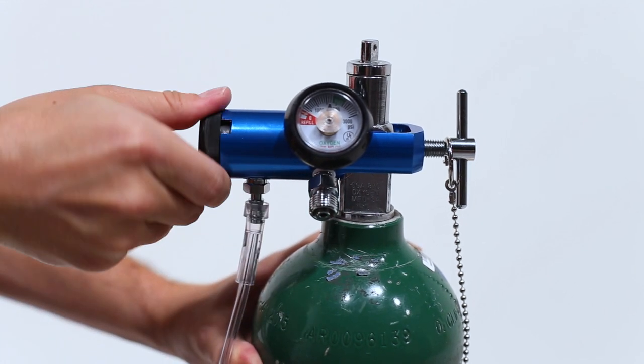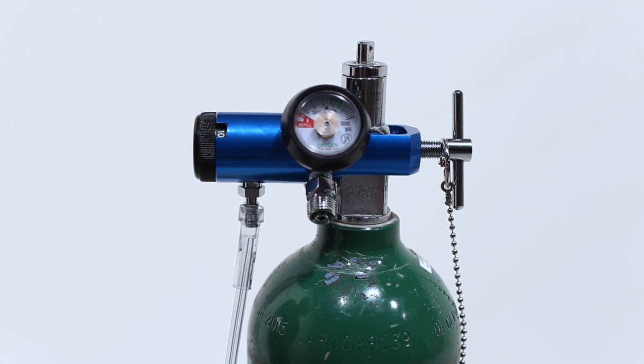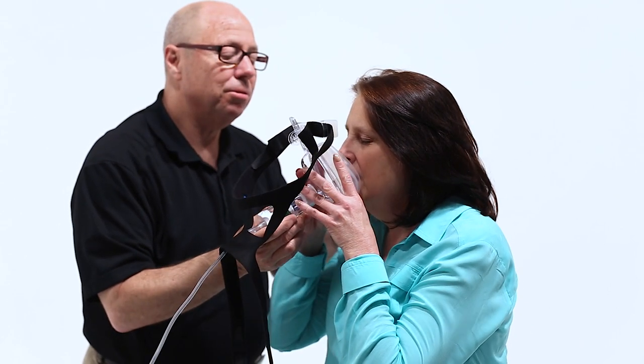After you connect the oxygen tubing, you will adjust your flow settings to 10 liters per minute. Do not exceed 10 liters per minute. Once you feel the flow come through the mask, you are then able to place it on your patient.